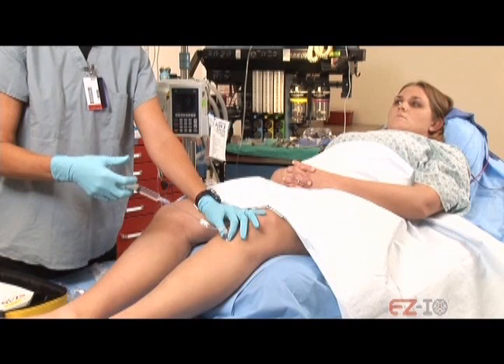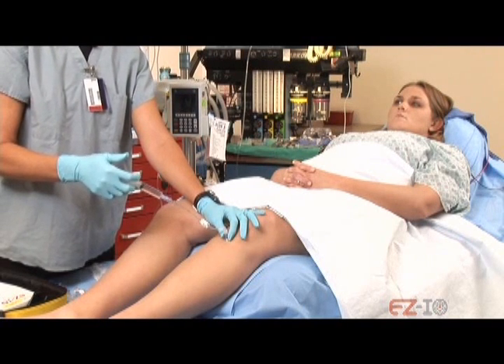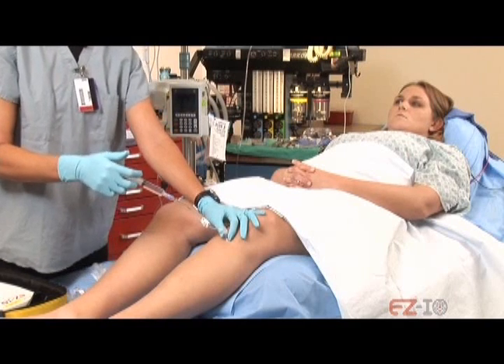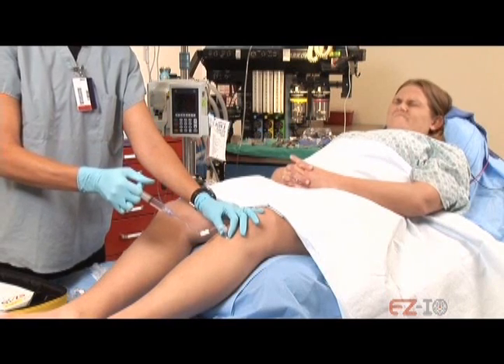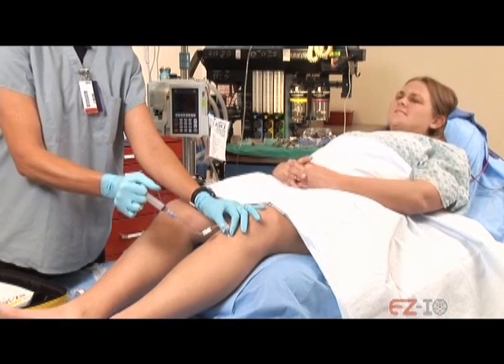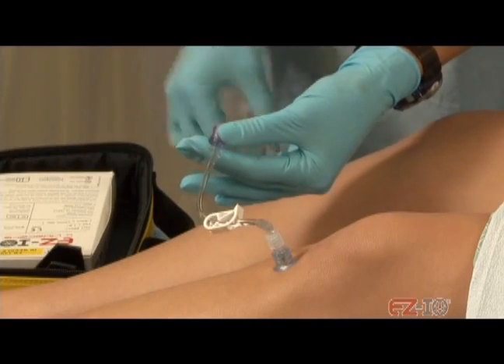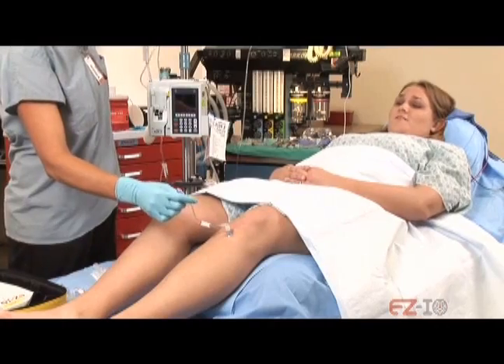All right, now this next flush needs to go in pretty quick. It's going to take me about 5 seconds, so I'm just going to count down with you. You're going to feel some pressure and some stinging pain when I do that, and then I'm going to be done in 5 seconds, okay? Are you ready? Yes. Okay. 1, 2, 3, 4, 5. Okay? All right. What's your pain level right now? Like a 4. Okay.